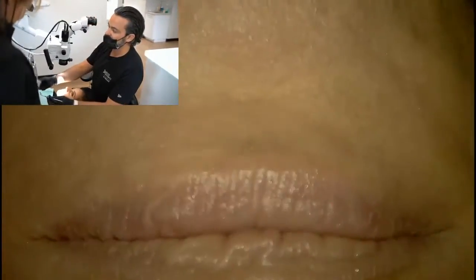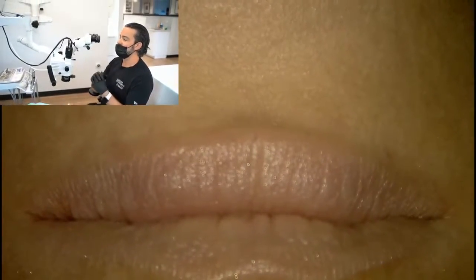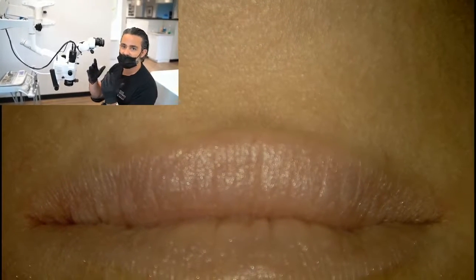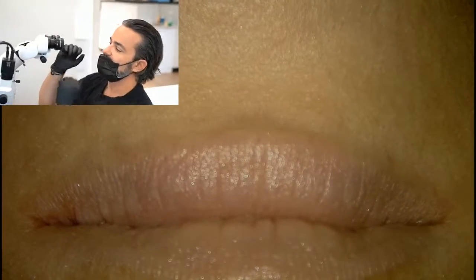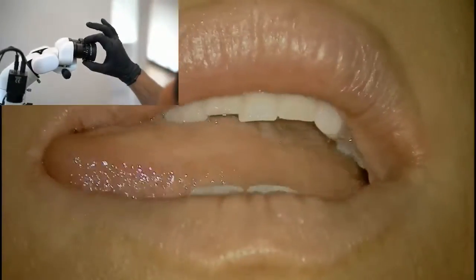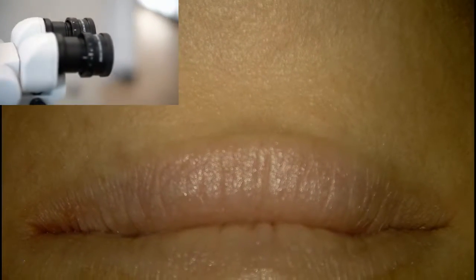Okay, so a question came up about touching the microscope. There's a couple things, and a lot of manufacturers do this part differently. It's the ability, if you wear glasses, contacts, if you have cups that come out. Now, on the Seiler scope, you can first adjust your correction if you have corrections in each eye.